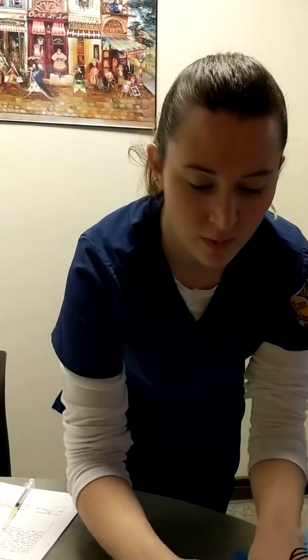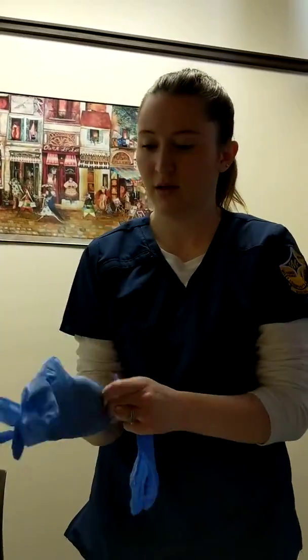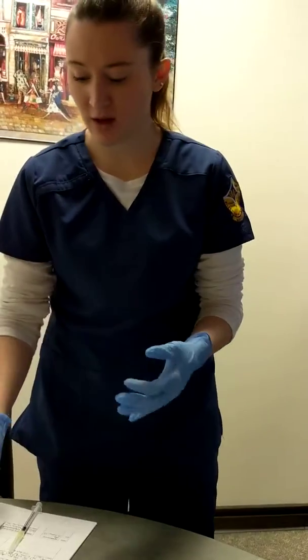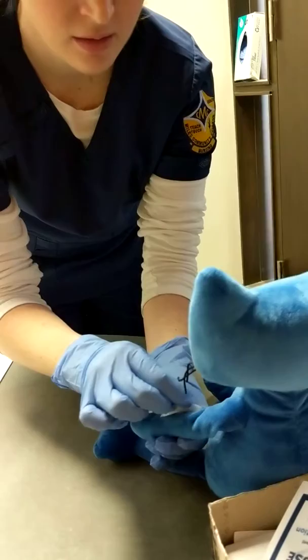Alright, and I'm going to look at your forearm here, Skip. Alright, so we're going to go right in here, in your forearm. We're going to be using a brand new alcohol swab. Clean off that area.